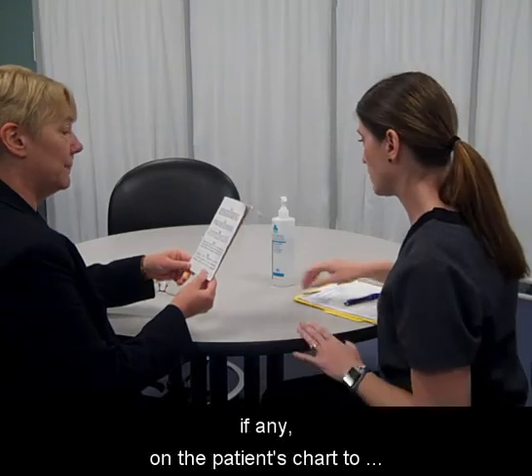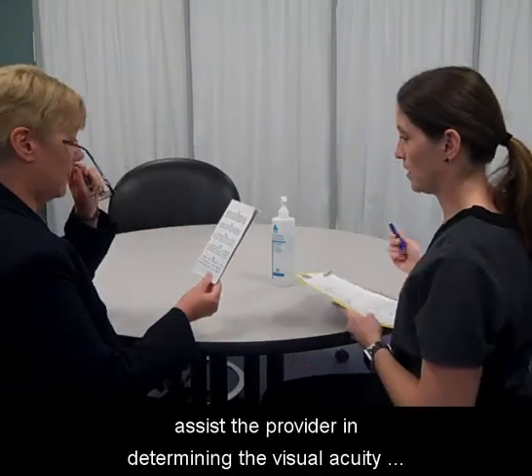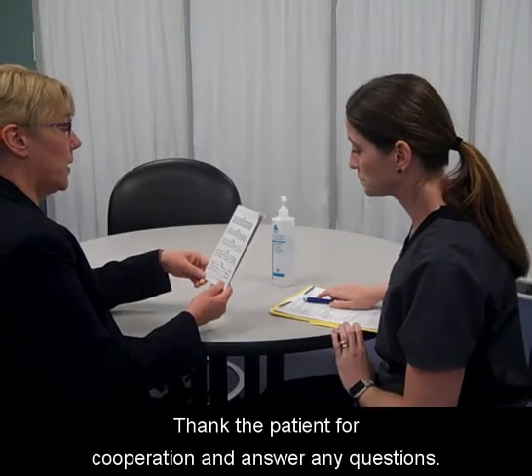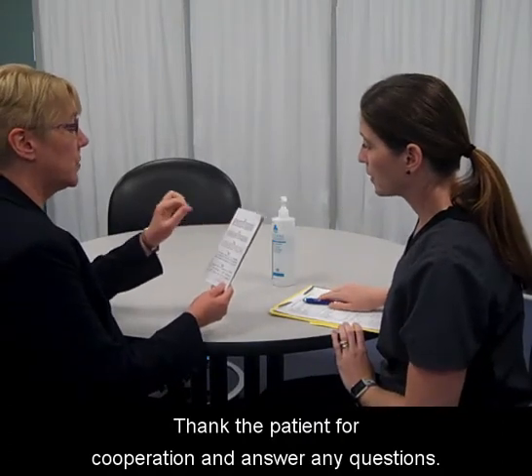Record the results and problems, if any, on the patient's chart to assist the provider in determining the visual acuity of the patient. Thank the patient for cooperation and answer any questions.